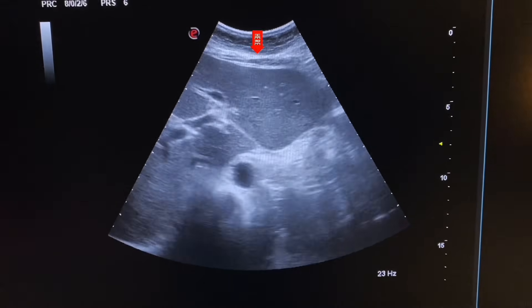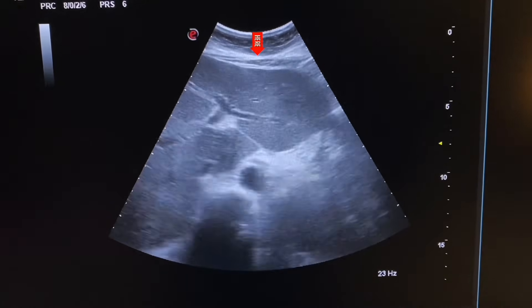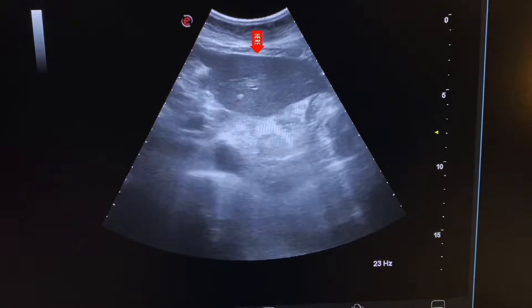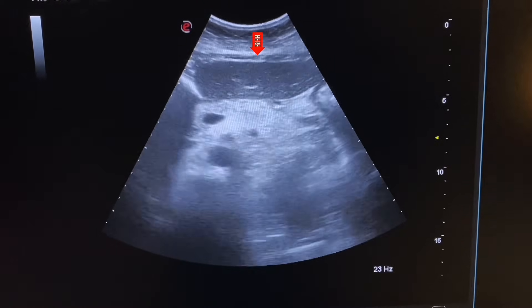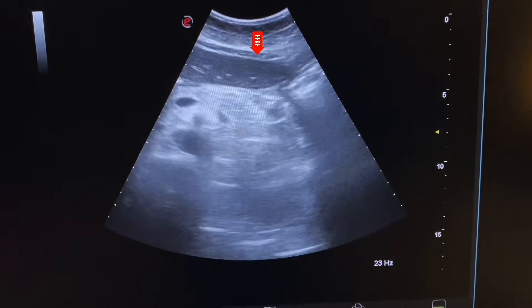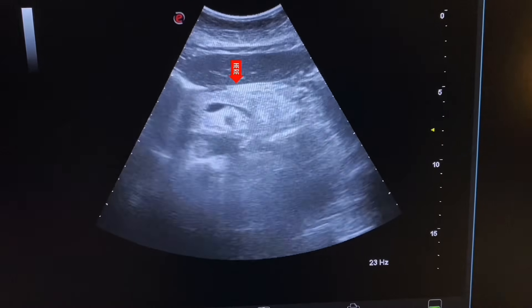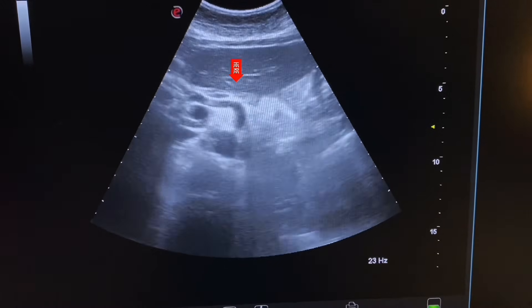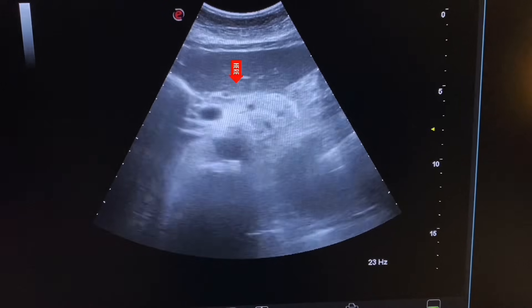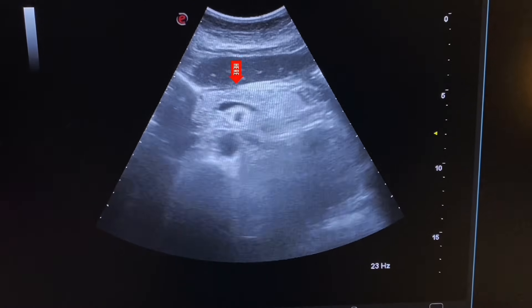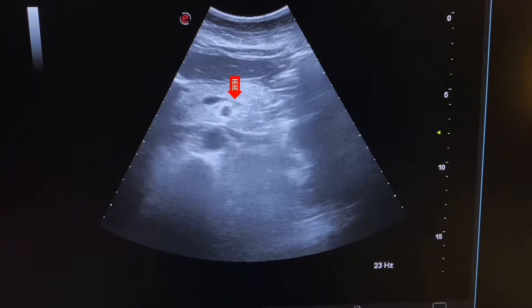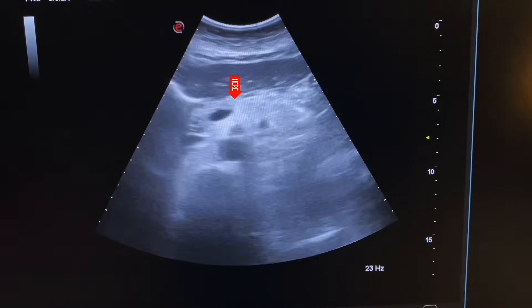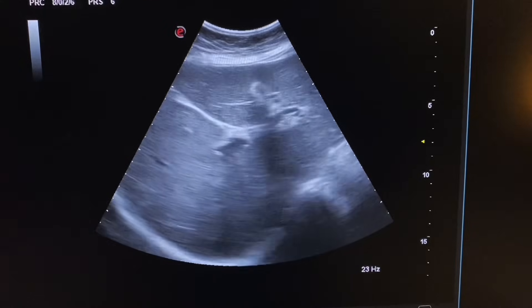We start scanning from the epigastrium, placing the probe in a transverse position. Here we see the left lobe of the liver, which is mildly echogenic and shows a heterogeneous texture. Here we see the pancreas, which is also echogenic and normal in size. This is the splenic vein. For pancreas localization, first search for the splenic vein and then it is easy to locate the pancreas.